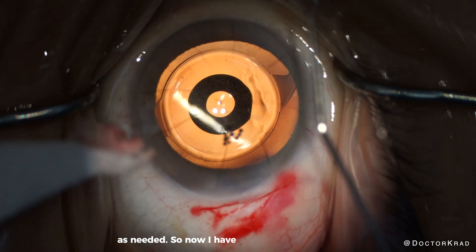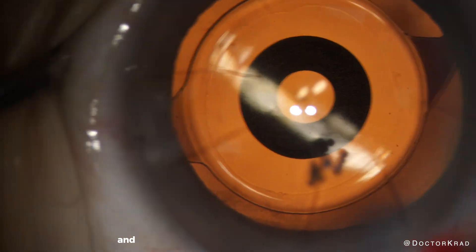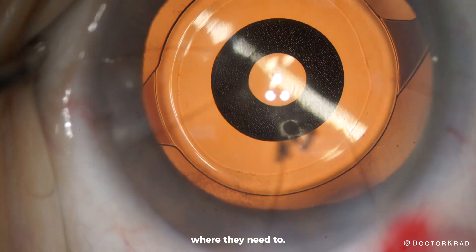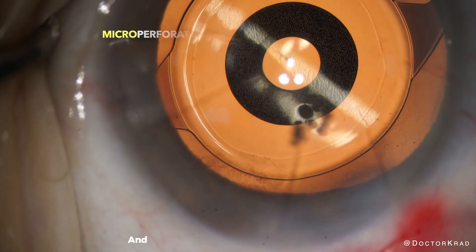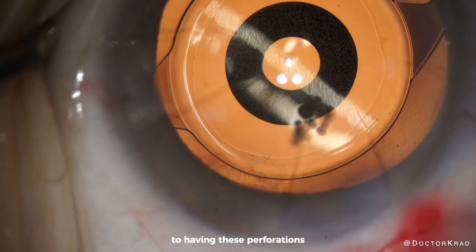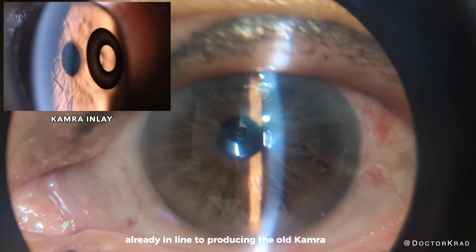Now I have an excellent eye pressure and perfectly sealed incisions. I'm showing you how I turn off the fixation light and turn it on again — this is just to make sure the patient is fixating where they need to. You can see micro-perforations in the inlay, thousands of them. I wonder if there's any other utility to having these perforations, or if it was just an economical decision because things were already in line for producing the old KAMRA inlay.